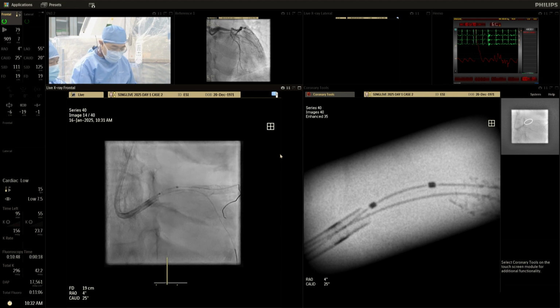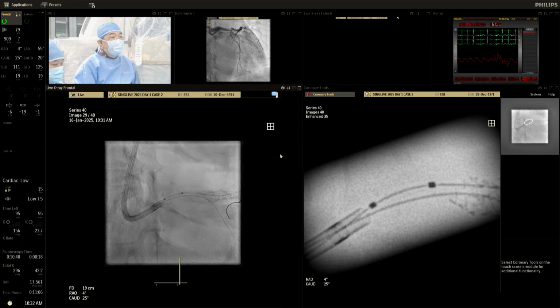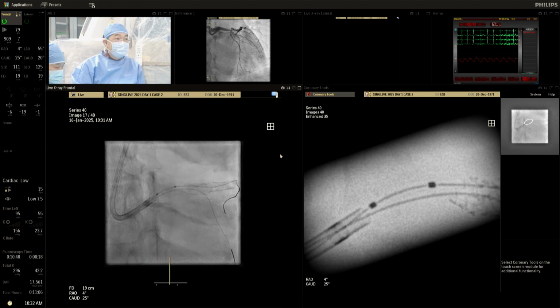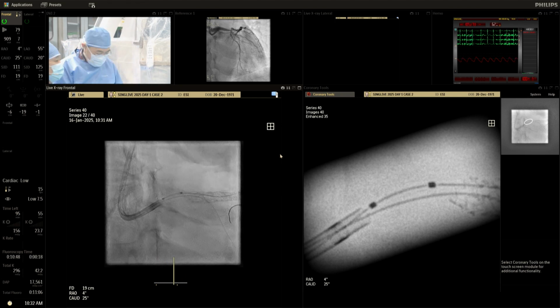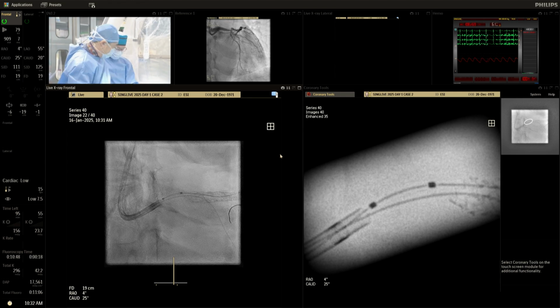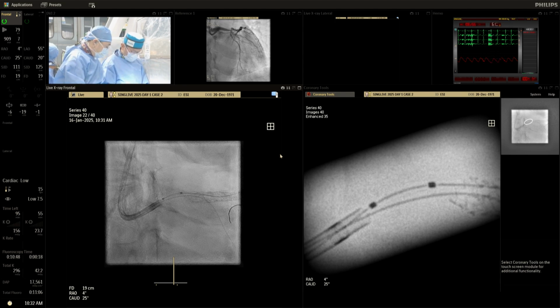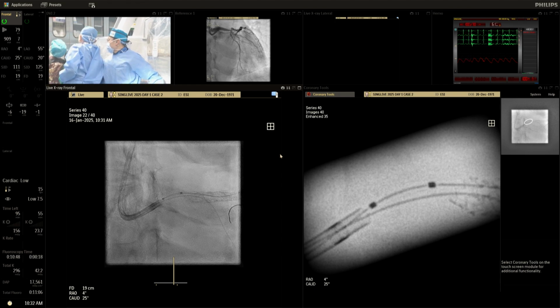It's always a risk to put the side branch wire. You always get that trapped part that may get lifted up, but sometimes we need the side branch wire to protect the side branch. So 5.0, short one. Let me have the 5.0 short one. Only one set. Okay.